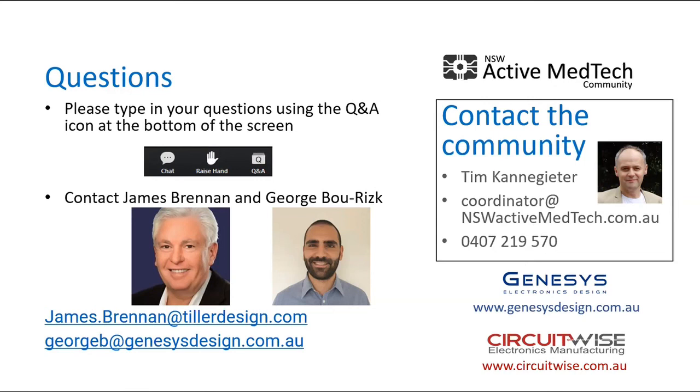So times are obviously changing and moving more towards that smartphone design, but it is important to keep in mind that when it's possible to move away from really critical potential hazardous events occurring, when you can avoid those by having a display that is otherwise not on a smartphone or embedded OS, it's usually favorable to do so, simply because it makes it a lot easier for getting certification.